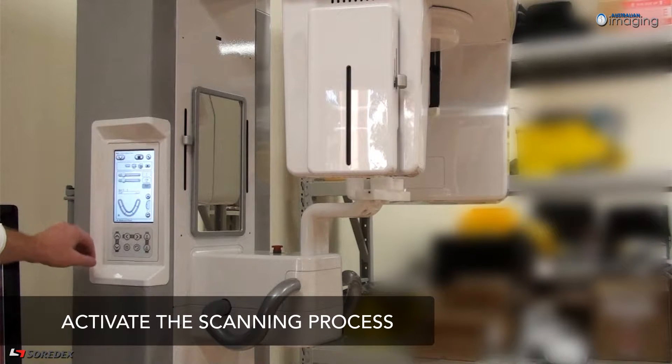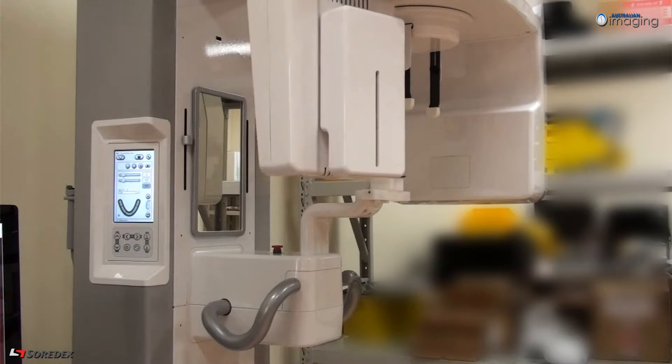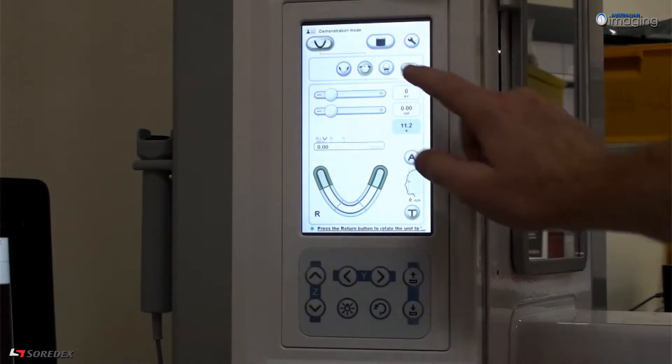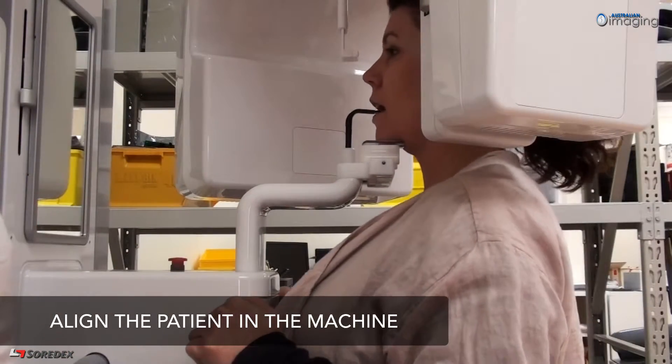On the control panel, select the 2D modality and press the return button to rotate the 2D sensor into position. Then choose your desired imaging program from the options of adult, child, or bitewing. Place the appropriate bite piece and chin holder into the unit.